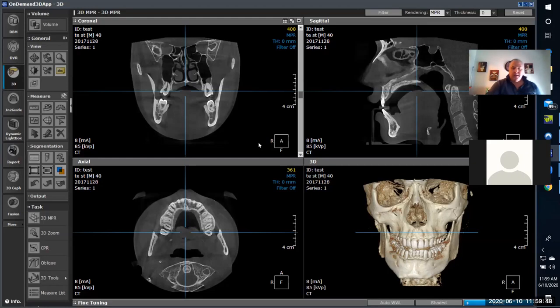This will be a series intended to help current users of their HDX Will CBCT learn how to get the most out of their CBCT with the on-demand software. During these web discussions, if there are additional topics that you want covered, please let me know. A couple of housekeeping things: some of the topics to be covered in this web series are going to be endo diagnosis, implant planning, orthodontic evaluation, fusion evaluation, and the TMJ evaluation.